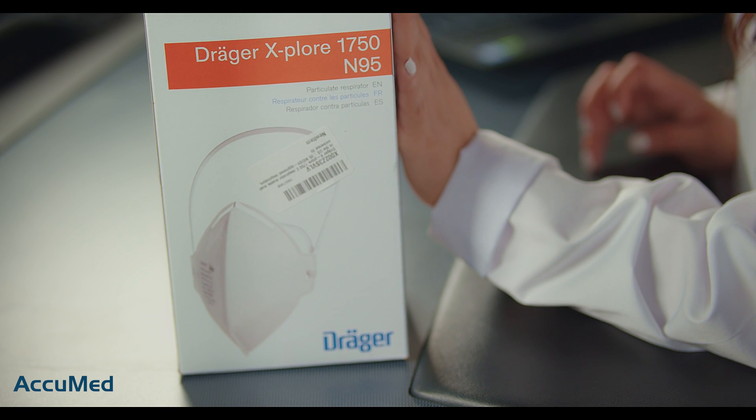Hello everyone and welcome to the AccuMed channel. Today we have another request video. This request was given to us through Reddit, and according to this Reddit user, these respirators are also part of the government stockpile. The respirators we're going to be reviewing are the Dräger X-plore 1750 N95 respirator. Let's go ahead and look at the listing before we try them on.